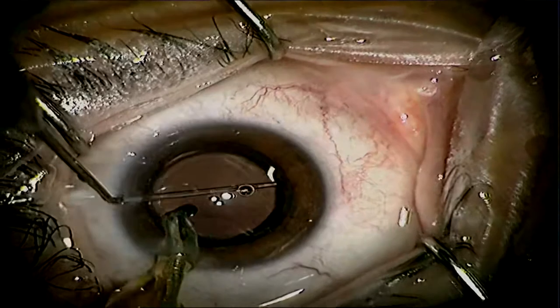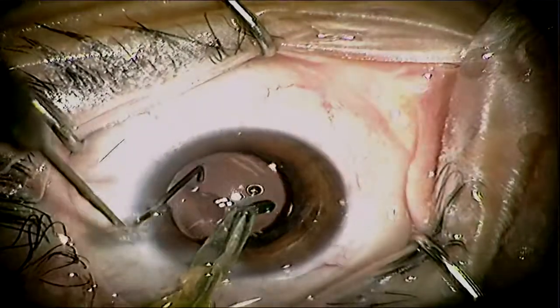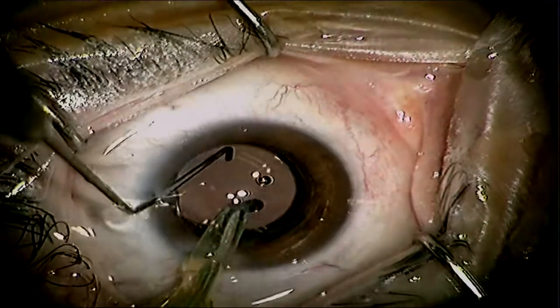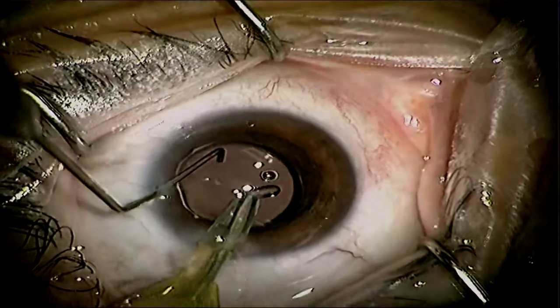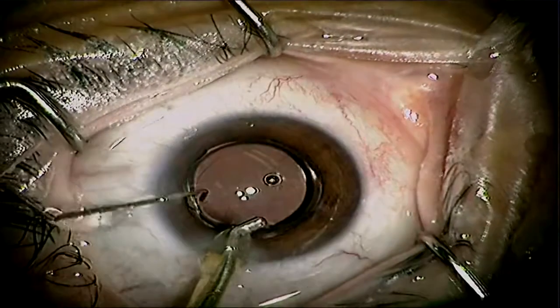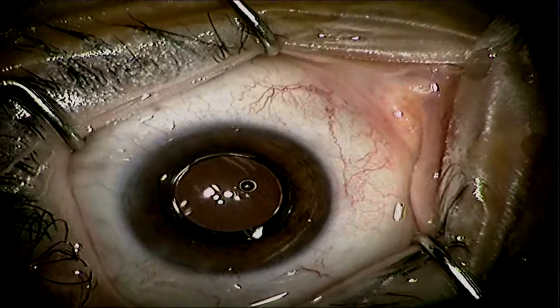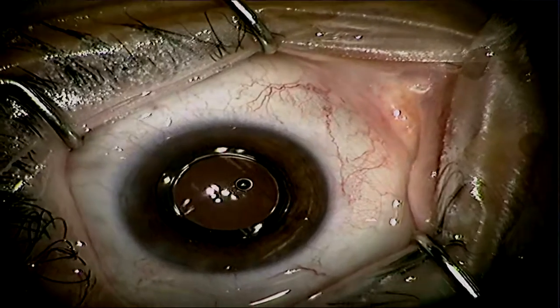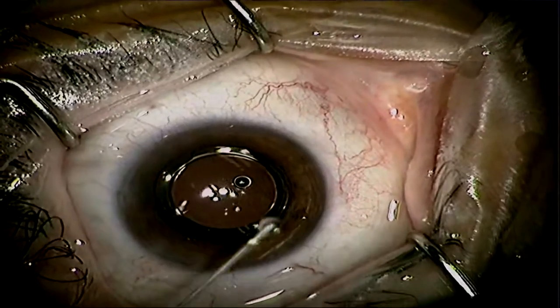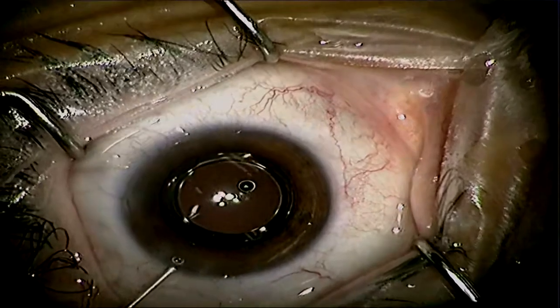The hydrostatic pressure from the BSS bag allows us to distend the anterior chamber and expand the capsular bag to its maximum size, because it is a large lens, so we do need as much of the bag open as possible. After you've attained the proper positioning of the lens, we can seal the wounds. Thanks very much.